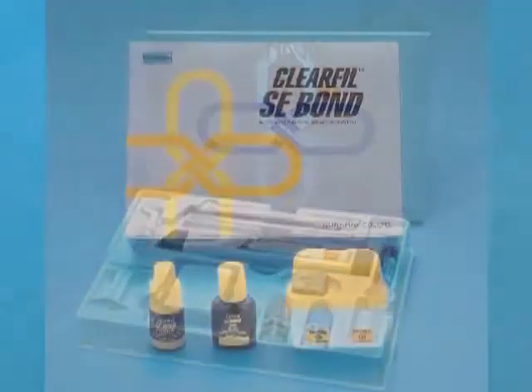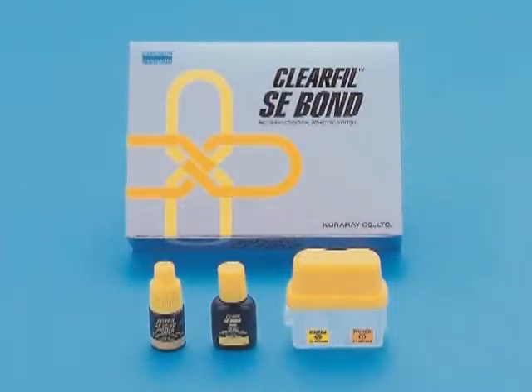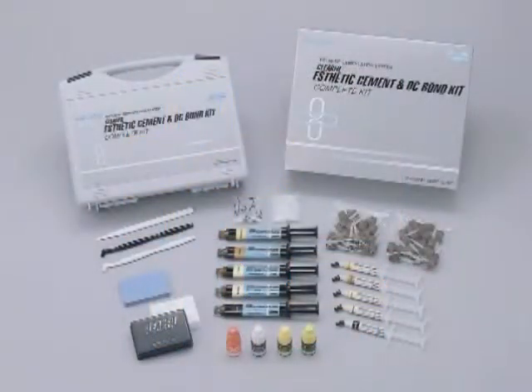Leave it to Kuraray, the world's leading manufacturer of dental adhesive products like the legendary Panavia Cement and Clear Fill SE Bond, to solve this dilemma. Kuraray's Clear Fill Aesthetic Cement and DC Bond Kit is just such a product. This new product carries with it excellent research and development, which has produced an innovative adhesive and cement that provides everything you need for fast, simplified systems of bonding and cementing of all aesthetic restorations. Before talking about the actual techniques, I would like to explain the basic components of this product.